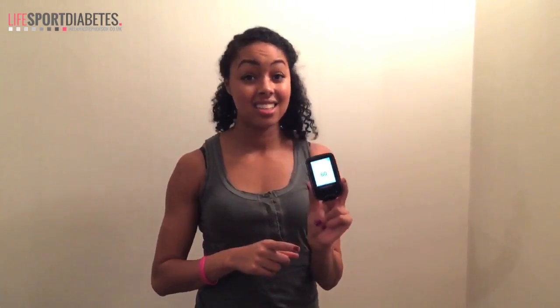I've attached my new sensor and scanned it to make sure it has started. It's now counting down — 60 minutes until my new sensor is ready to use.